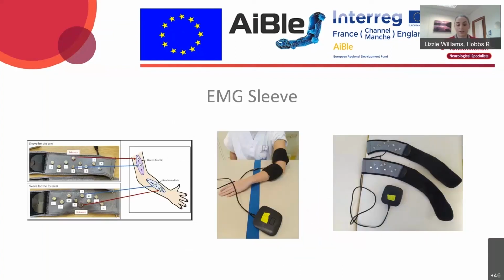So traditional outcome measures, albeit insightful, were not the primary purpose of completing the data collection. The main objective was to collect EMG recordings of post-stroke individuals completing functional movements. To get this data, the participants each wore an EMG sleeve that came in 2 parts, one for the upper arm and one for the forearm. The sleeve had 32 electrodes, and the Portsmouth University team used these channels to record muscle activity during the functional movements. The initial EMG sleeve was wired.